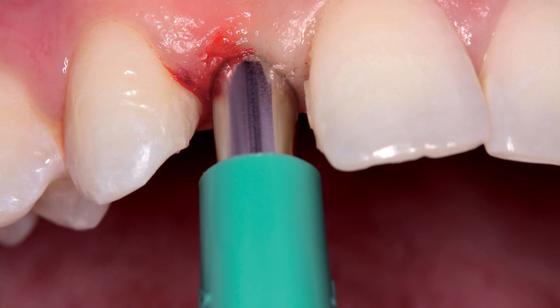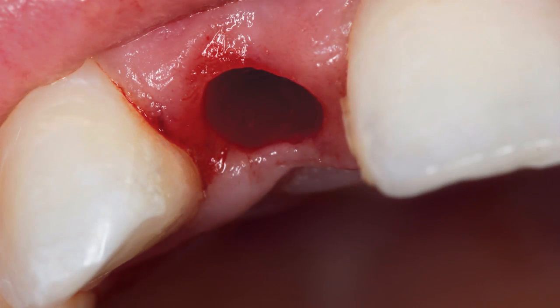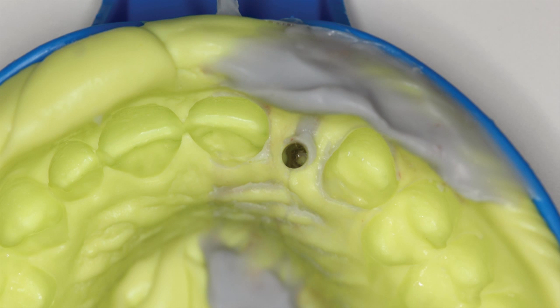A tissue punch was then utilized to access the healed implant site. Because of the relatively non-invasive nature of the tissue punch, the final impression was taken during the same visit. The cover screw was removed and an impression coping was hand-tightened into the conical internal hex connection of the Hahn tapered implant. Panasil vinyl polysiloxane material from Kettenbach was used to create a final impression so the dental lab could fabricate the restoration. Based on the final impression, the lab produced an inclusive titanium custom abutment and an aesthetic Bruxer anterior crown.